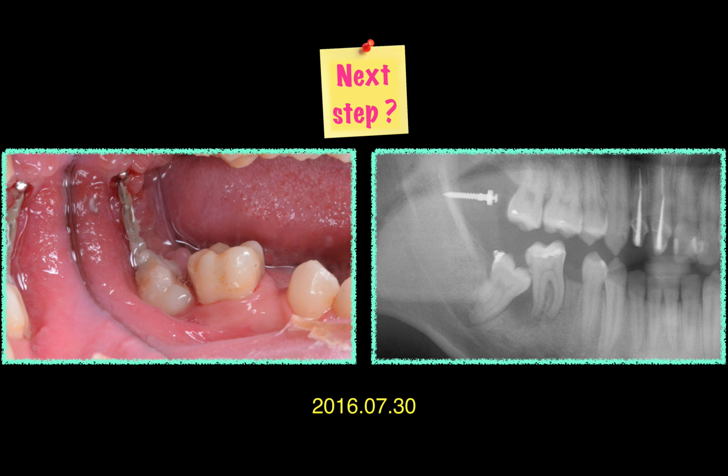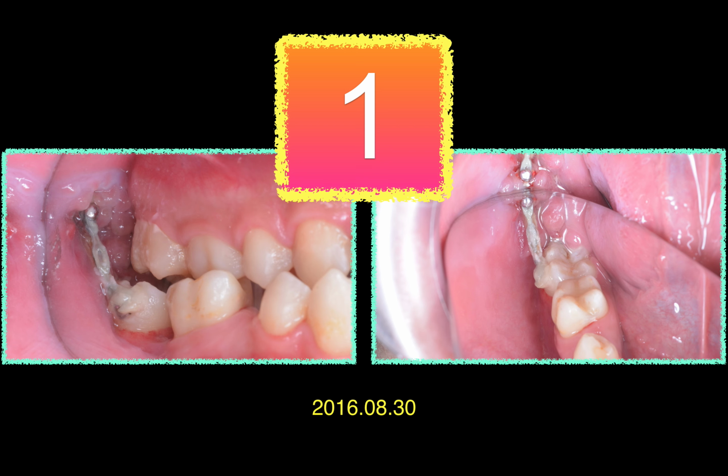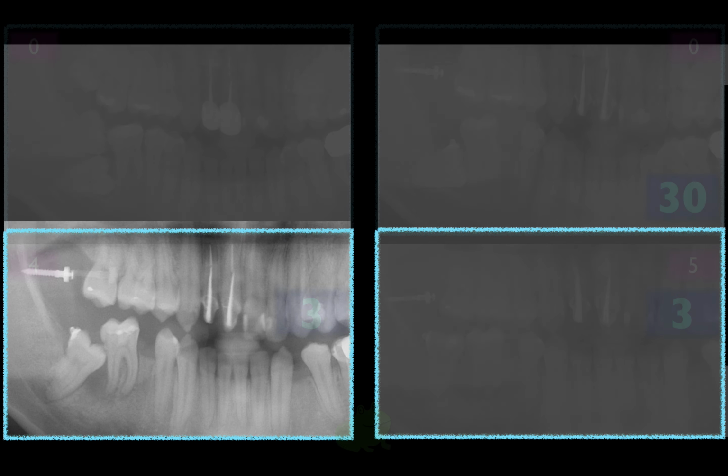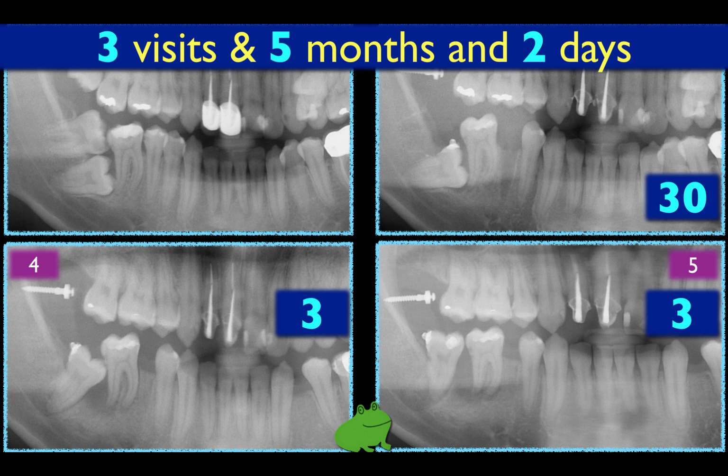And guess what? The next month, we upright the second molar. One month later, we're done. Can you imagine? Let me give you a mathematical calculation. This patient came to my office for 3 visits. We spent 5 months and 2 days.